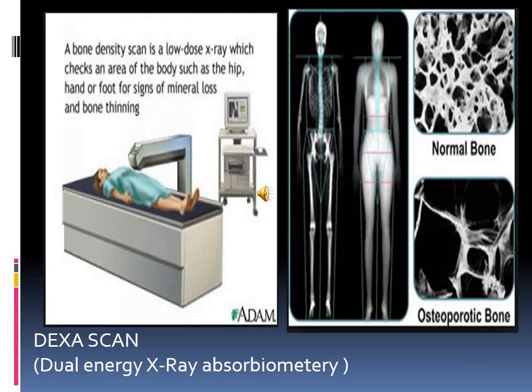Usually, we study osteoporosis with a DEXA scan. DEXA scan is dual energy X-ray absorptiometry, which is very effective for studying the generalized bone density and lastly the diagnosis of osteoporosis.